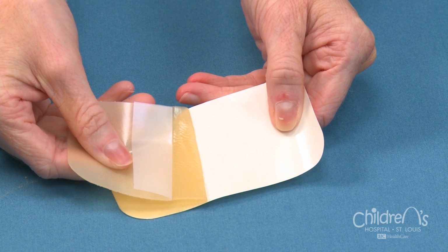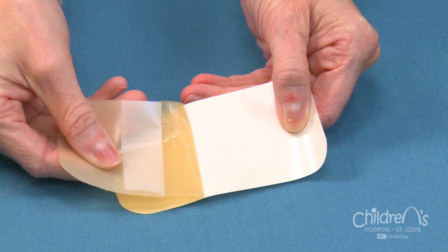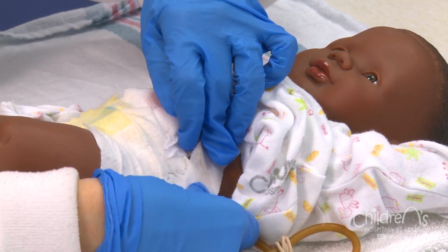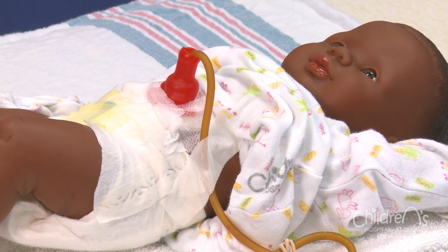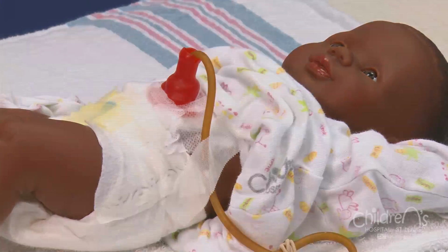You can place the Duoderm on your child's skin and then tape the extension set to the Duoderm dressing. After the skin prep gets sticky, lay the tubing on the skin prep and cover with tape. Remember to move to different spots in order to help prevent skin breakdown.